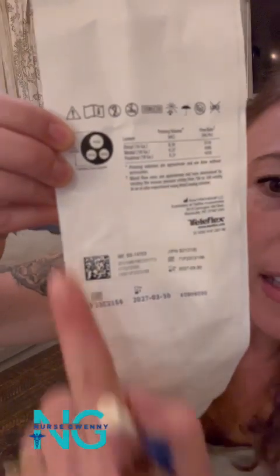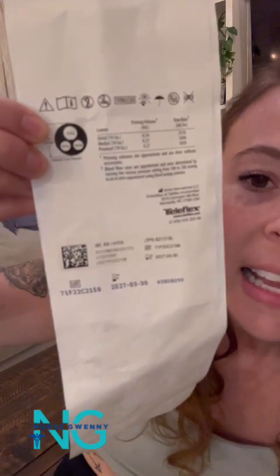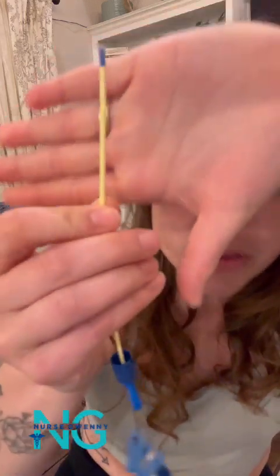This particular central line is a triple lumen catheter. Triple meaning it has three lumens — kind of like straws inside of it. Two of them are 18 gauge and one of them is 16 gauge, and they're capable of up to 60 mils per minute per each lumen, so you can get a lot of medication or fluid bolus through it.